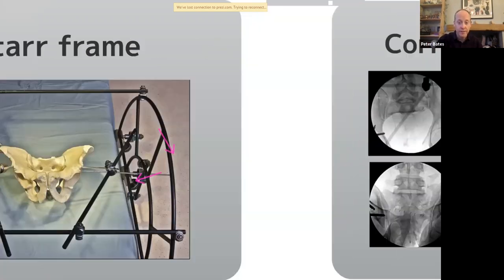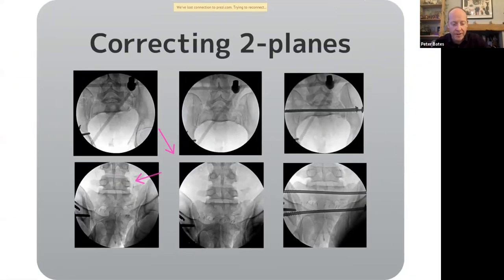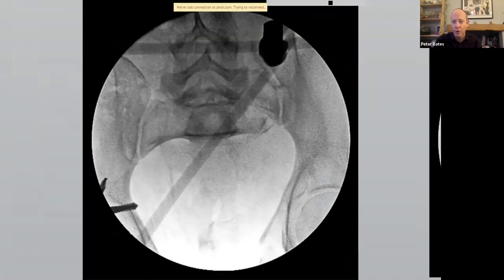It works really nicely. But aside from that, because that's one of the minutiae I said, what I wanted to get to you was this idea of correcting the pelvic displacement in two planes. So going back to that inlet-outlet thing I was boring on about earlier on, here we go. This is the normal side of the pelvis. Can you see right here? See there? That's what it should look like, but not on this side. On this side, it comes there, it stops, and then it restarts again over here with that step I was showing you earlier on, right?